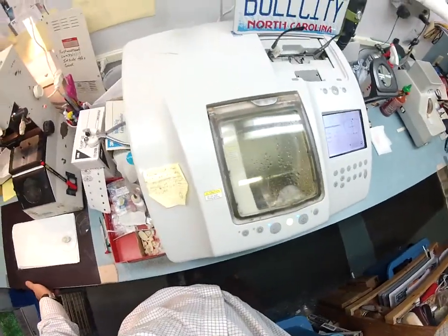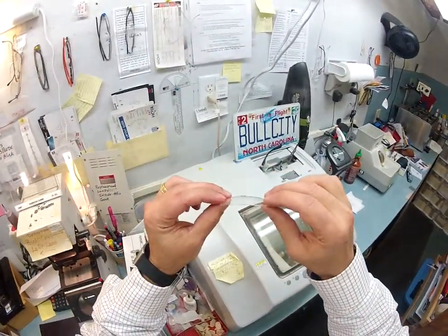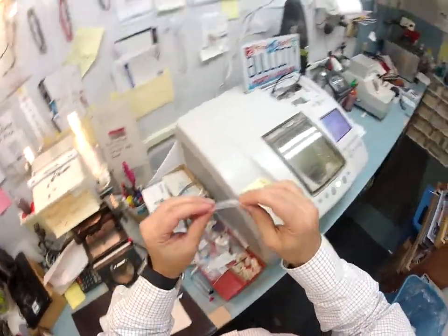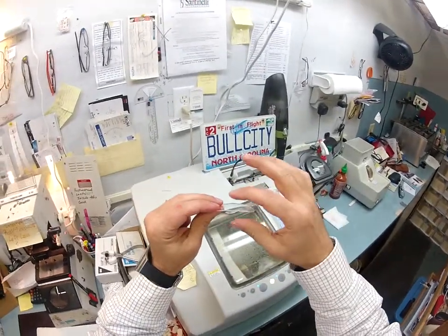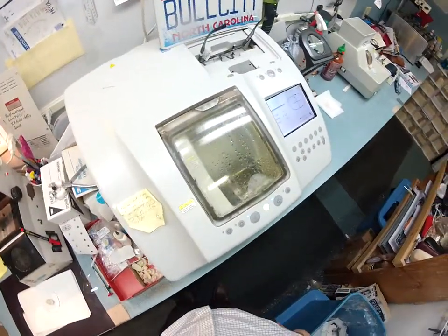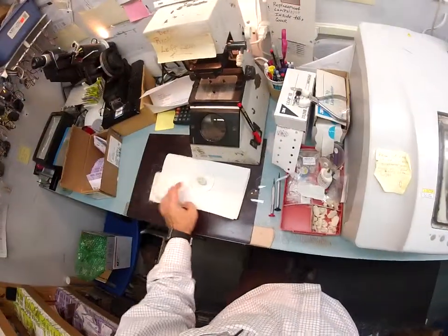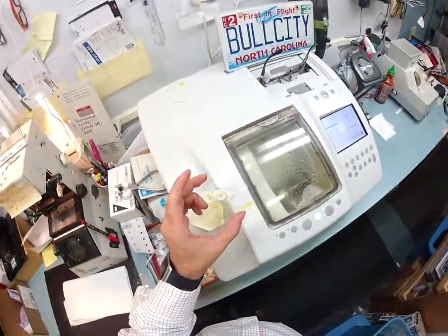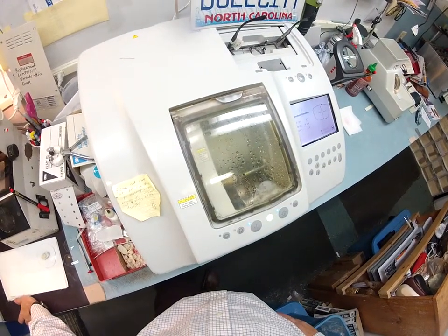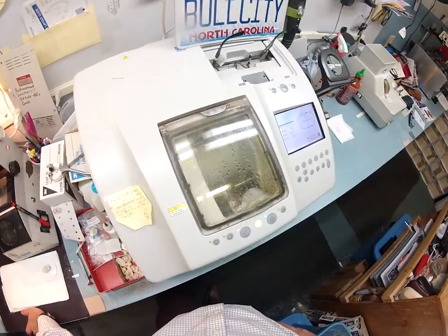The lenses you are receiving are an aspheric polycarbonate lens. Aspheric means your original lenses have a certain curvature, but this is much flatter, so it's a better cosmetic appearance. Spherical just means round; aspheric means it starts off round but flattens at the edges. It's a higher quality lens. Most places have an upcharge or surcharge — this is where I start. In fact, they are unbreakable, bulletproof up to .22 caliber, and have both UVA and UVB protection.